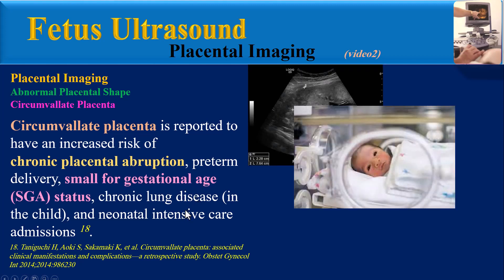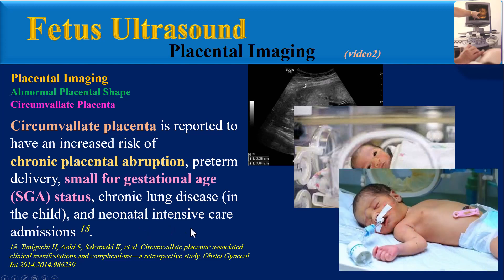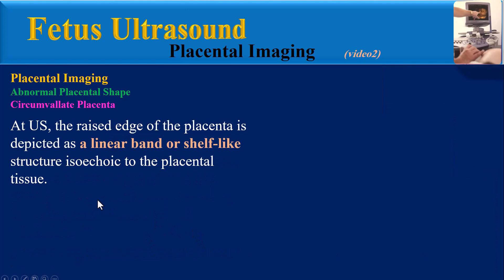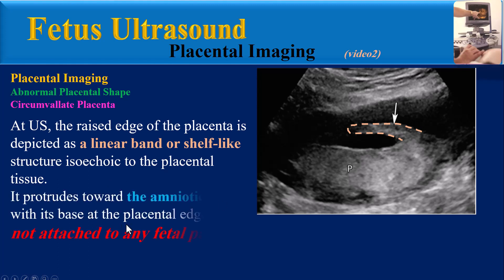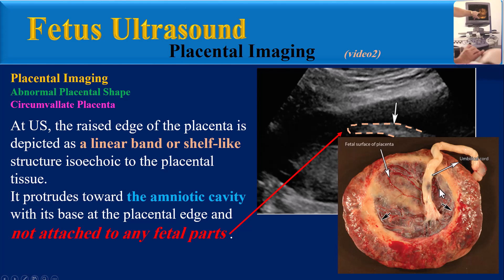Regardless of whether it is benign, circumvallate placenta is reported to have an increased risk of chronic placental abruption, preterm delivery, small-for-gestational-age status, chronic lung disease in the child, and neonatal intensive care admissions. At ultrasound, the raised edge of the placenta is depicted as a linear band or shelf-like structure isoechoic to the placental tissue. It protrudes toward the amniotic cavity with its base at the placental edge and is not attached to any fetal parts.